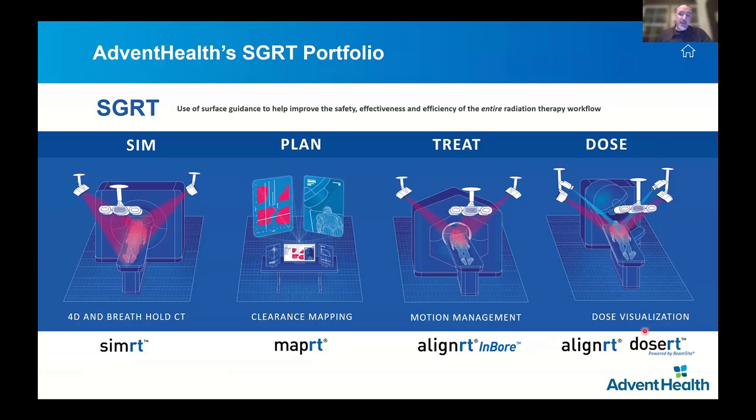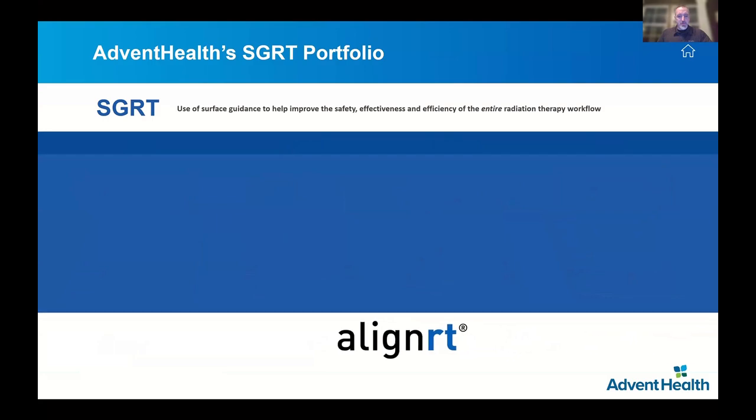We've also introduced the Cherenkov imaging system called DoseRT, which exploits the Cherenkov effect, an effect we get for free when we irradiate our patients. Our patients emit light from the irradiated area, and these intensified cameras allow us to pick up that radiation by gating them to the beam pulses of the Linac. And so we will explore a lot of these things as we go through.